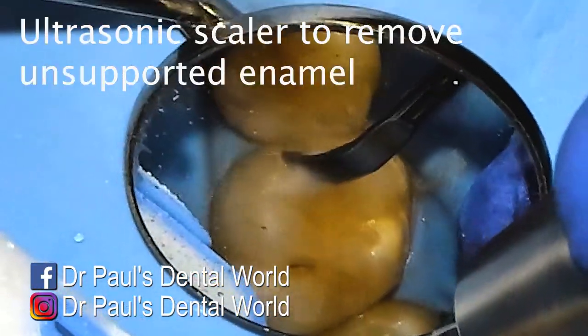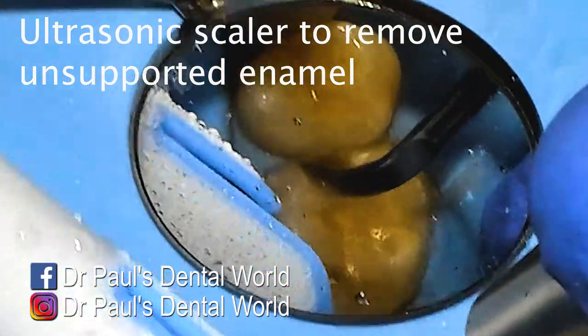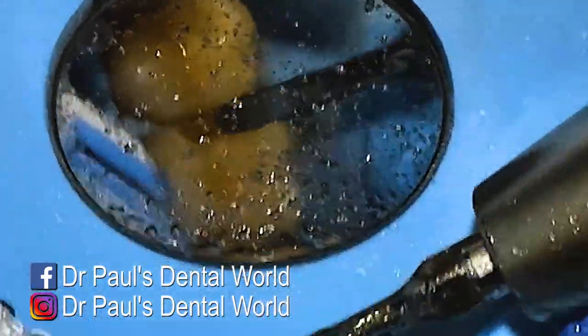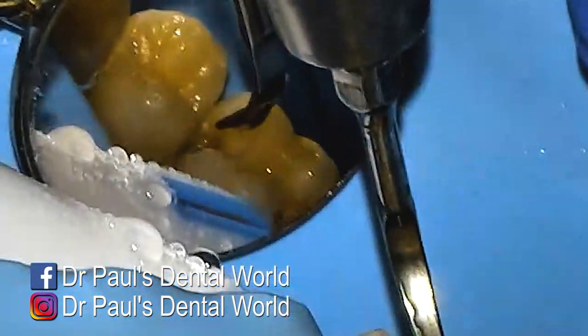Once I've done that with my high speed, I'll then come to it with an ultrasonic scaler, which is basically removing any unsupported weak enamel. You can do this with a burr, but it is very easy with a burr to hit the next door tooth and cause some damage to it. So an ultrasonic scaler is really good at it.